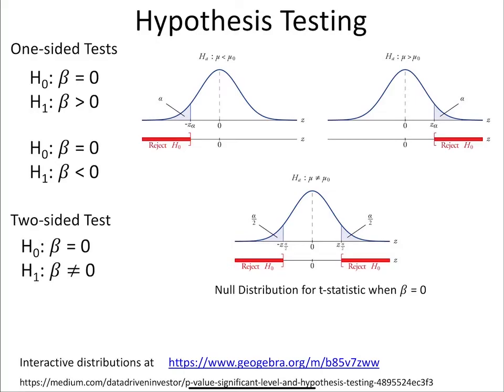Once we have that, we review what we mean by hypothesis testing and what thresholds we want to have. Typically in fMRI, there's a lot of one-sided testing done. If you're looking at a scan session, there's activation, typically something where you're just looking for positive activation, but you might also look for negative activation. If you don't really care about the sign, then you can do a two-sided test where you're just looking for beta not equal to 0.